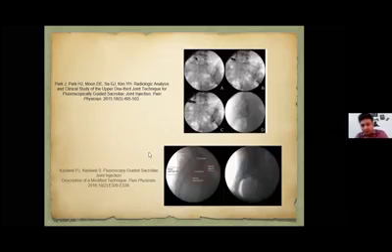So I would like to tell that usually we don't do this, but always try to take a lateral fluoroscopy view also when you are doing sacral intervention, and try to keep the needle a little bit above the S2 foramen in the lateral view.